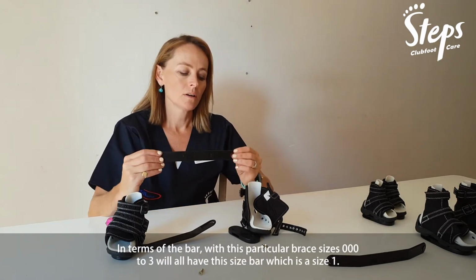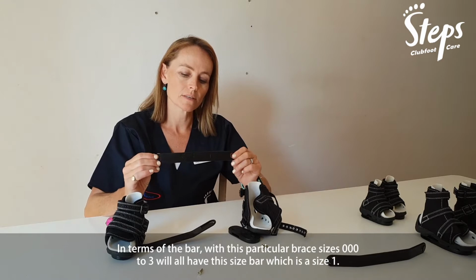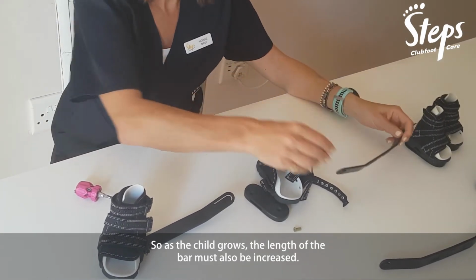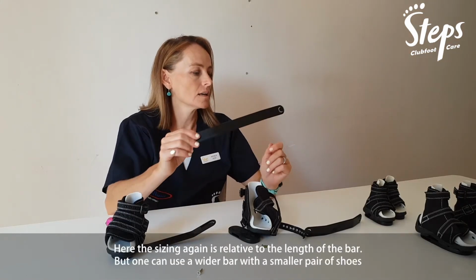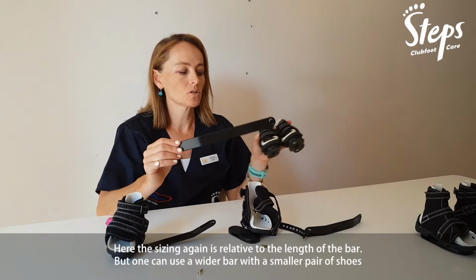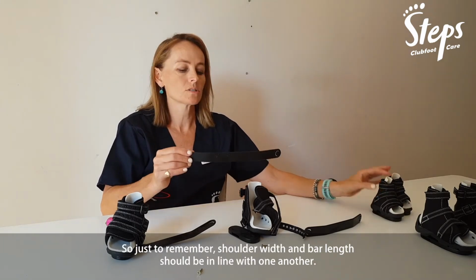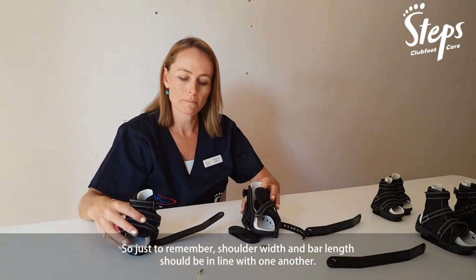In terms of the bar, with this particular brace, sizes 000 to 3 will all have this size bar, which is a size 1, and the size of the bar is usually measured according to the width of the shoulders of the child. So as the child grows, the length of the bar must also be increased. Here the sizing again is relative to the length of the bar, but one can use a wider bar with a smaller pair of shoes at the clinician's decision if they feel that the shoulder width is large but they have smaller feet. So just to remember, shoulder width and bar length should be in line with one another.